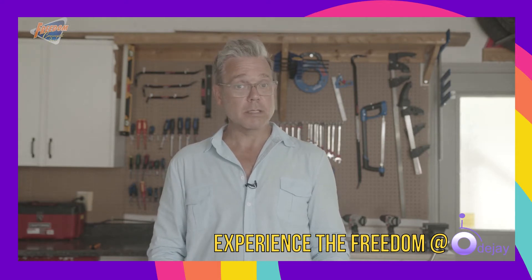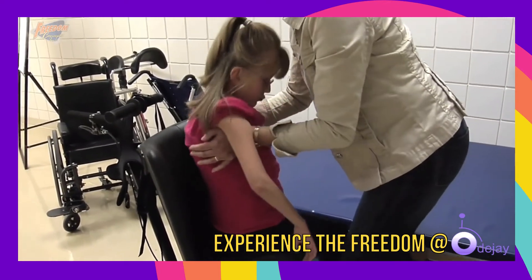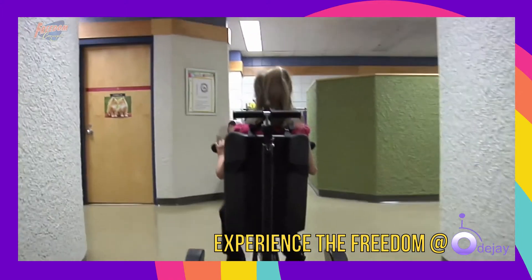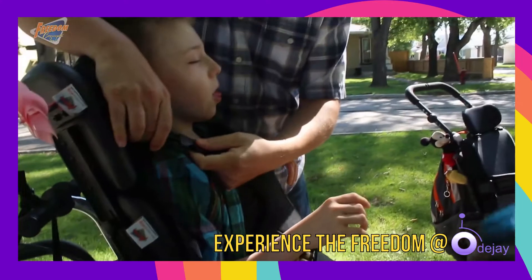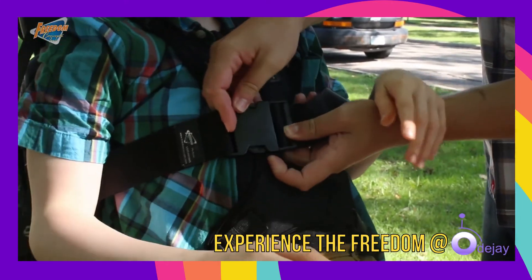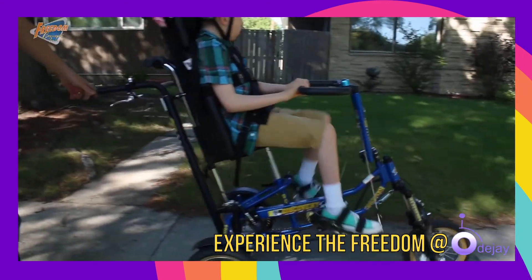And like all Freedom Concepts adaptive bikes, the Discovery series was created using the feedback we received from therapists, parents, and physicians. Our cycles work great for children with a wide variety of different conditions ranging from simple balance problems to more complex conditions such as cerebral palsy, spina bifida, down syndrome, autism, and many others.